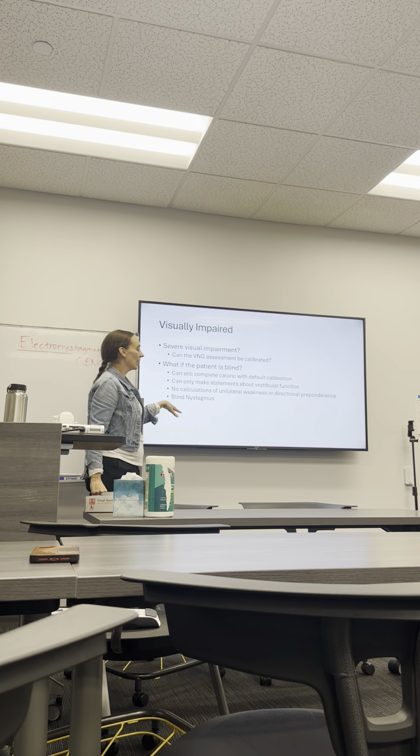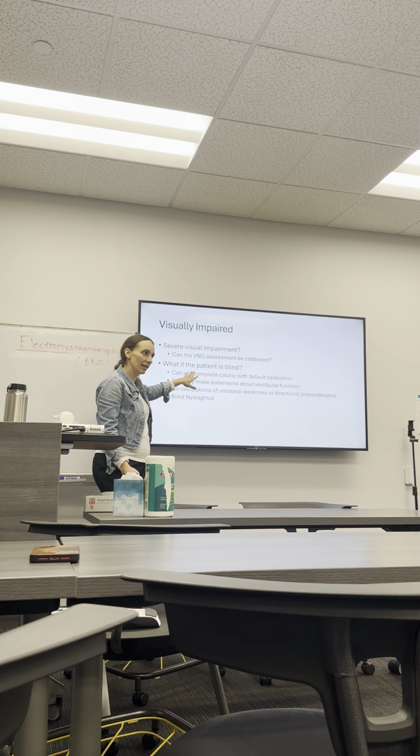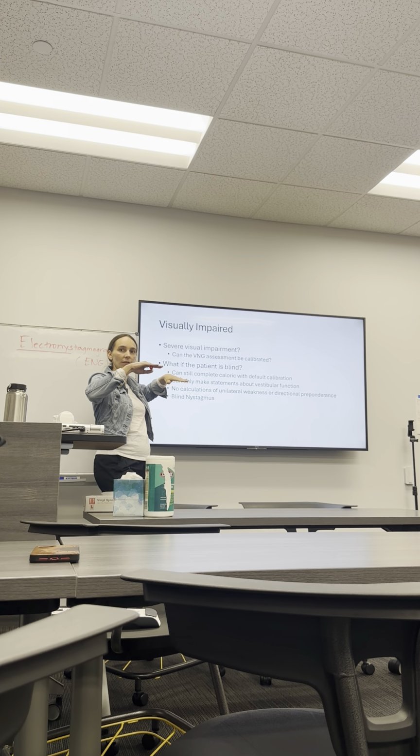Because we don't have an opportunity to provide fixation or a point of interest for the patients to look at during the caloric, and because we are operating with an ocular motor system that is atypical in some way, it would be inappropriate to say that one side is stronger than the other, because we don't necessarily know the underlying ocular motor system.